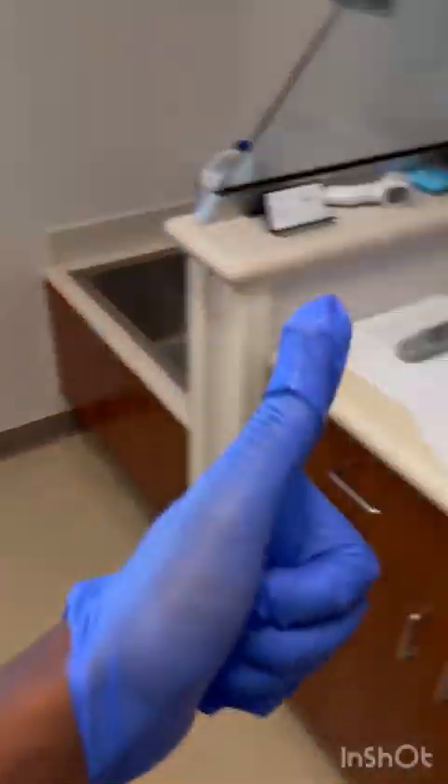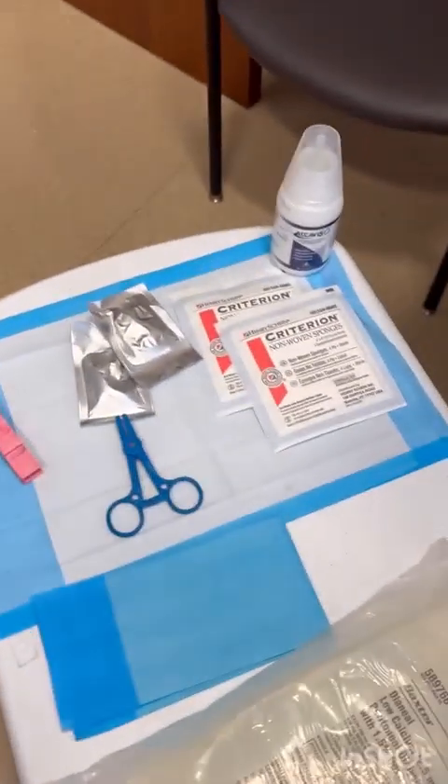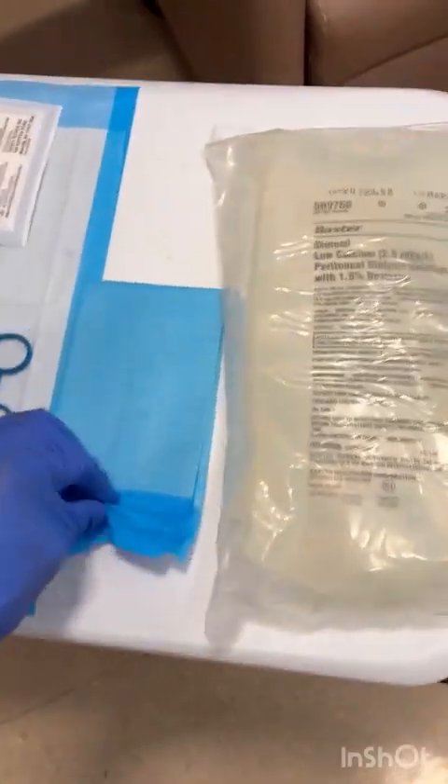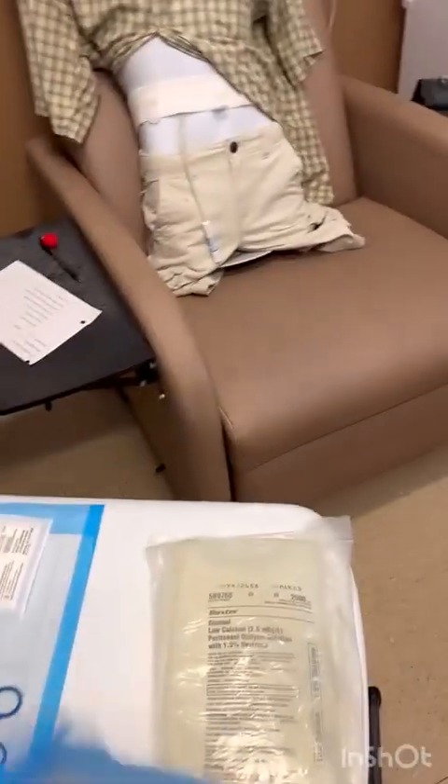You can just use a bleach wipe, but we nurses mix our own bleach because we're cool like that. Now I have my supplies ready: my gauze, my Alcovis, my clamps, my mini caps, my blue pads, and my dialysate.